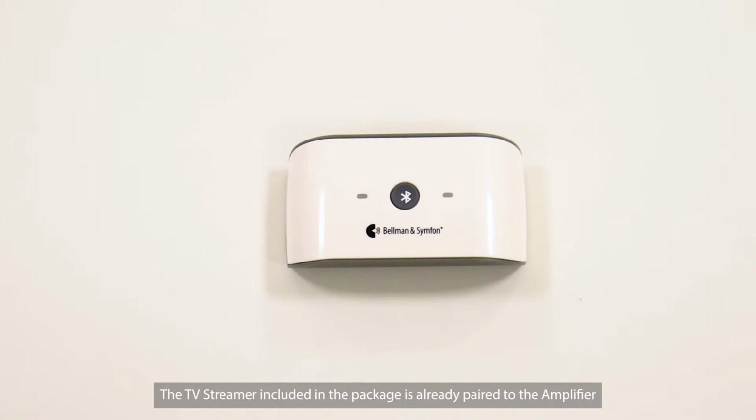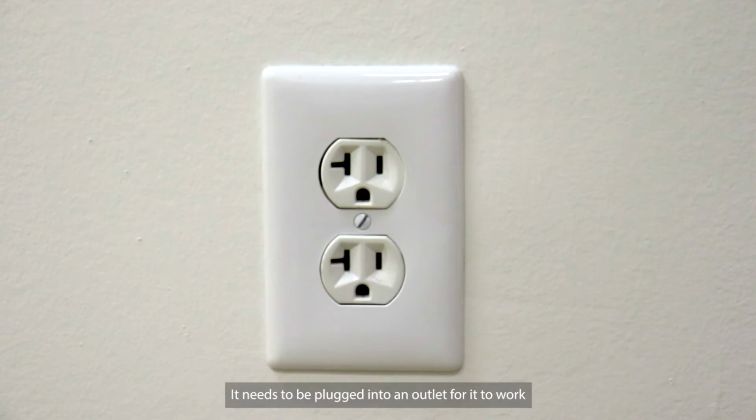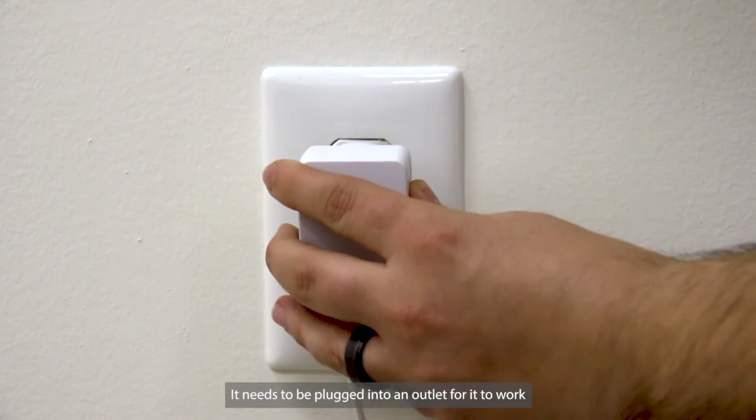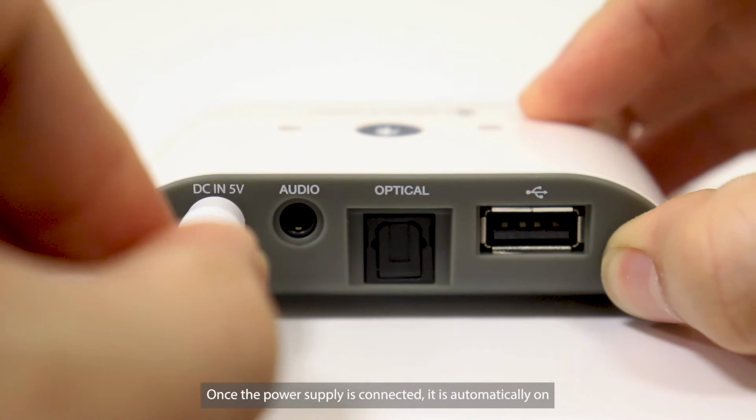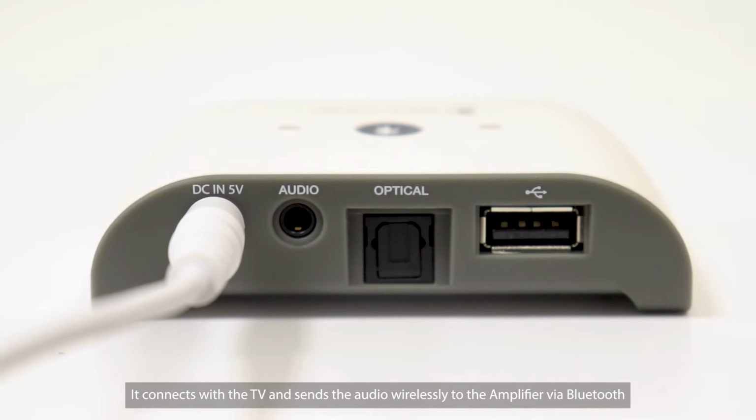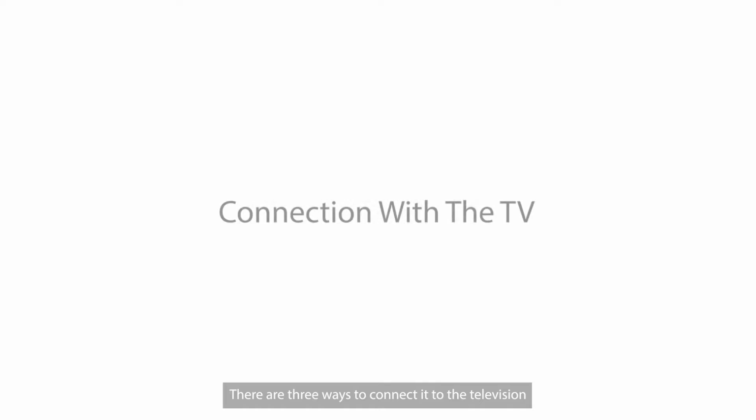The TV streamer included in the package is already paired to the amplifier. It needs to be plugged into an outlet for it to work. Once the power supply is connected, it is automatically on. It connects with the TV and sends the audio wirelessly to the amplifier via Bluetooth. There are 3 ways to connect it to the television. Please only use one connection at a time.